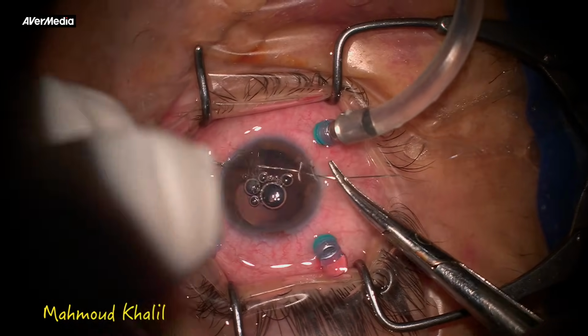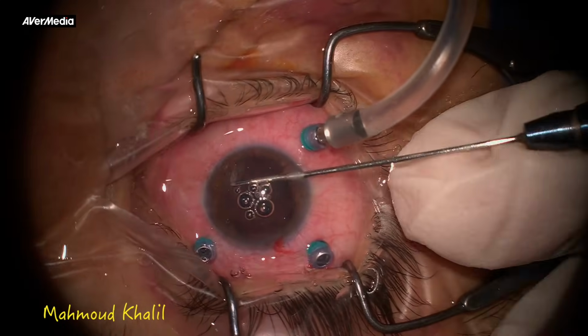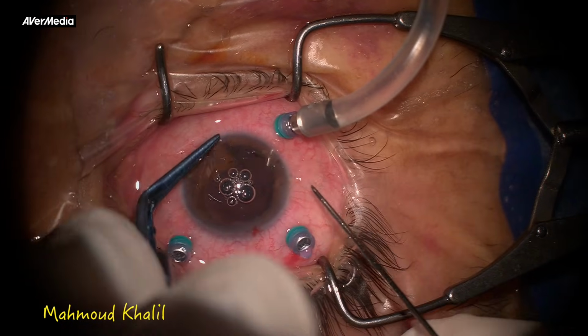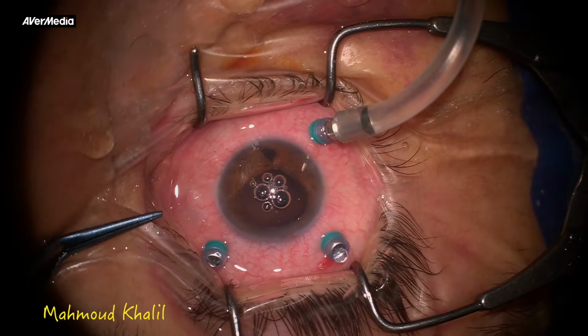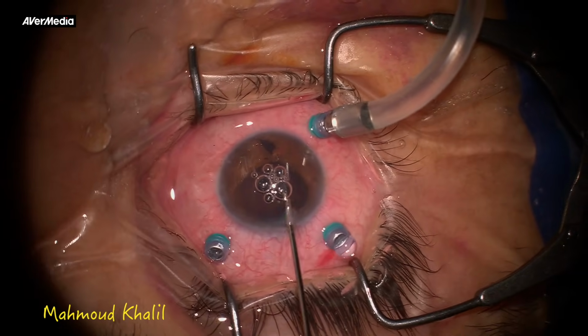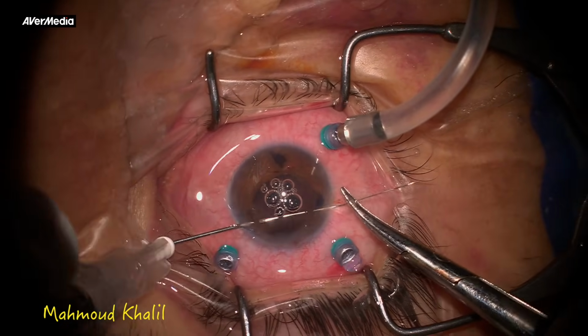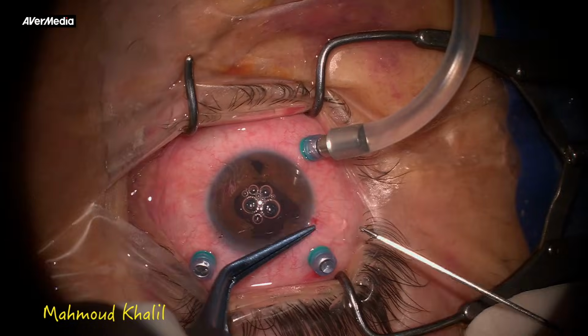Also in this case, as we see, there is a traumatic mydriasis. Repairing the iris from below and repairing the iris from above. Doing a suture at the lower iris, doing a suture at the upper one, and regaining the shape of the pupil.